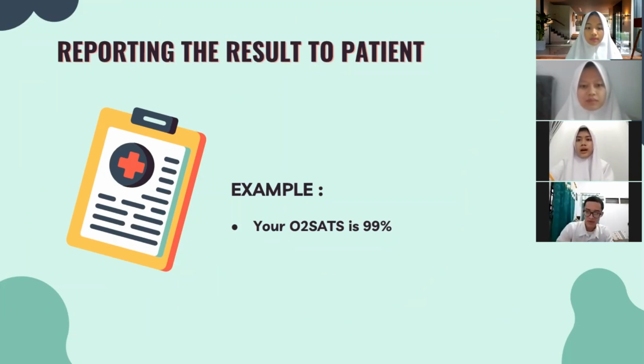Okay, I have a video about how oxygen saturation checking is carried out by the nurse. Please watch it carefully.